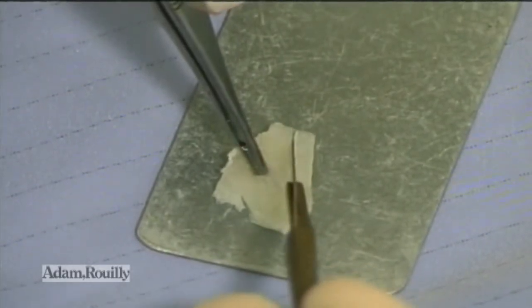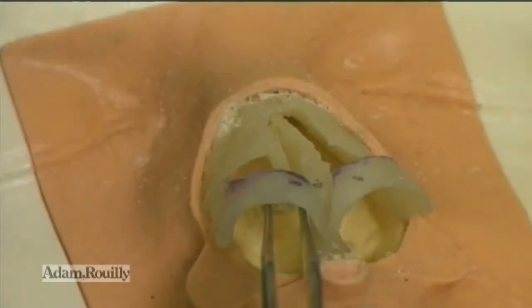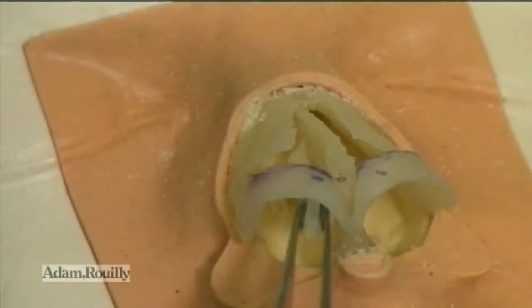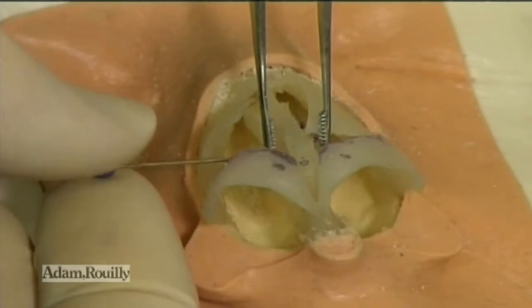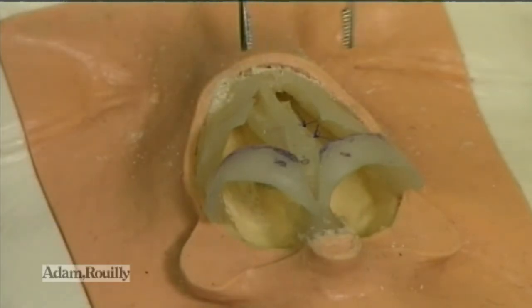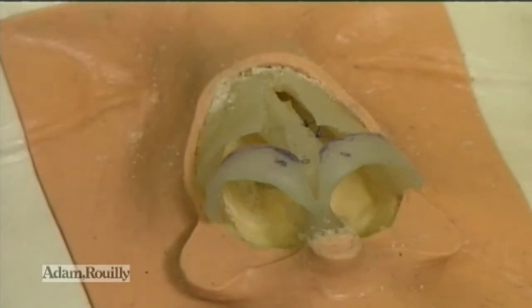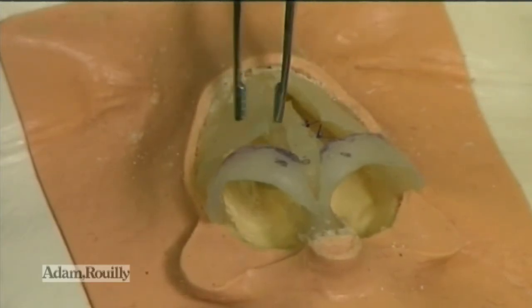The spreader grafts are about 5mm in width and ideally 30mm long. We put them below the level of the septal plane and secure them initially with needles and PDS sutures. We now have a septum that is considerably straighter. We are going to reattach the upper laterals to the septum in the upper three quarters, to prevent infero-medial migration of the upper lateral, but not in the lower quarter, so as to preserve the normal flaring that takes place in the caudal portions.